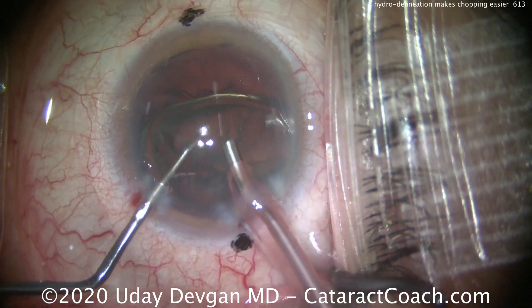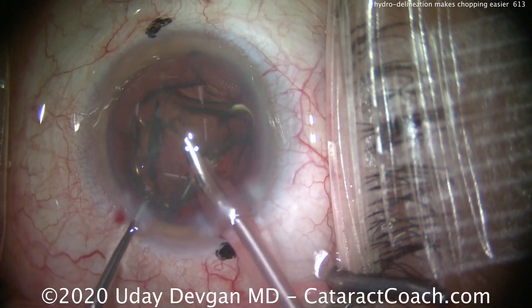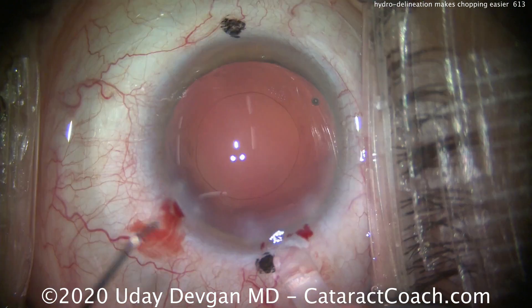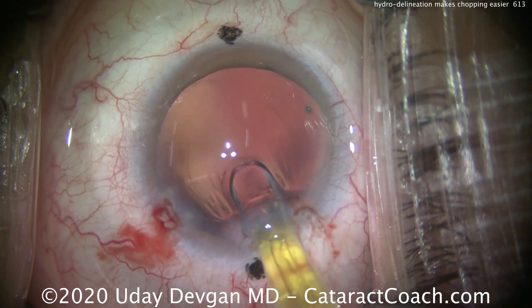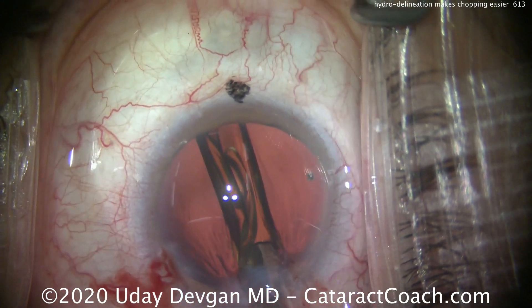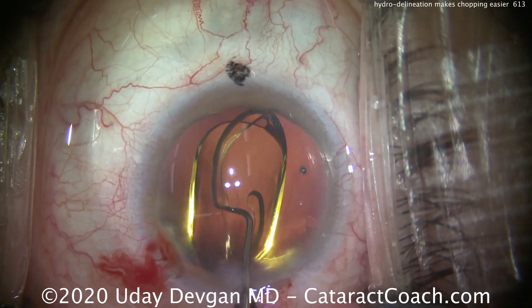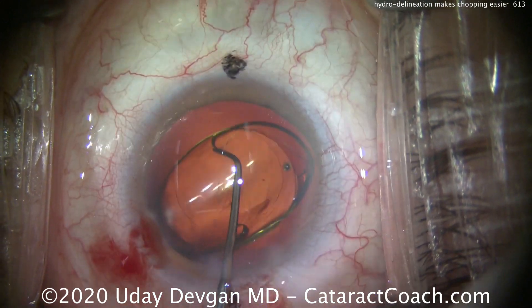Now for the epinuclear shell, we'll just use vacuum and get that whole epinuclear shell to tilt and tumble into the phaco tip, chopper in the safe position — and that's it. Here's the end of the case; it looks great. Next time you have a case like this, try to do a hydrodelineation first, get that golden ring, and now that smaller endonucleus can be chopped. You'll have a lot easier time chopping the smaller endonucleus than you would chopping the whole large nucleus.